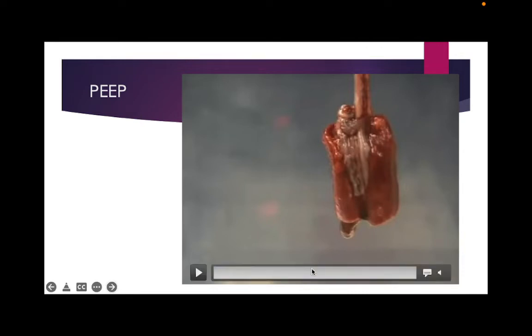Your patient probably needs PEEP, but they also might need some pressors, okay? It's not wrong on high PEEP to give them a little bit more inotrope or a fluid bolus. When you really get into trouble is if you have pulmonary edema and then you're giving more PEEP and then you decide to dump more fluid in. Don't play that game. Try to avoid that game, all right? Sometimes they are third spacing and you're in trouble and you just have to, but that's when you get into trouble.